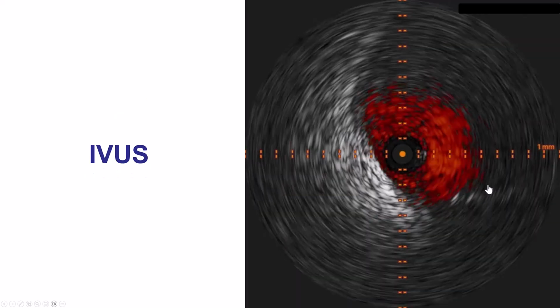We did insert a long sheath and then tried to advance a catheter all the way to the ascending aorta. However, the wire would stop before getting into the aortic arch. So what to do? We ended up obtaining access on the left, and then we did an intravascular ultrasound to try to determine what was happening in the aorta.